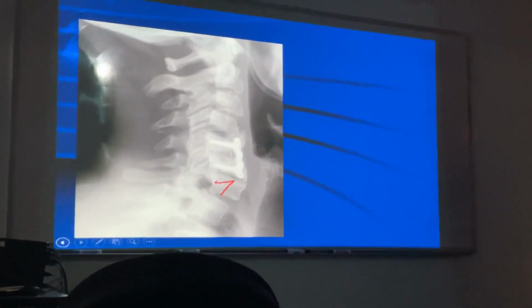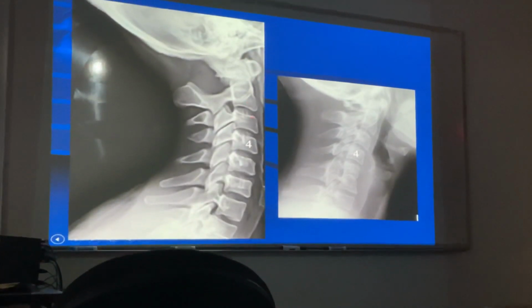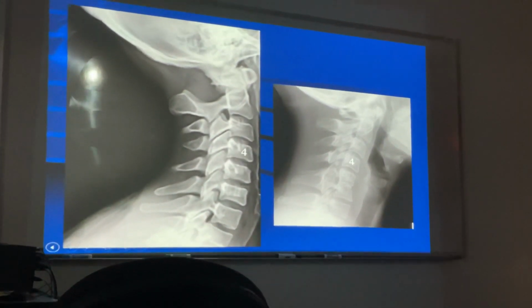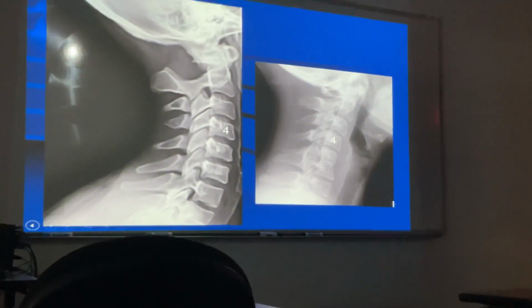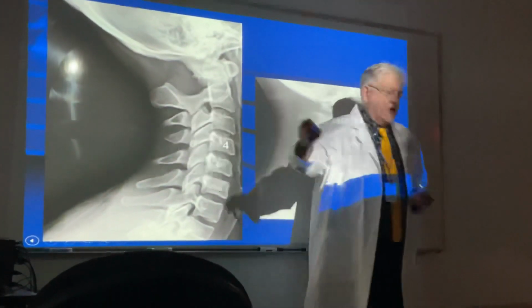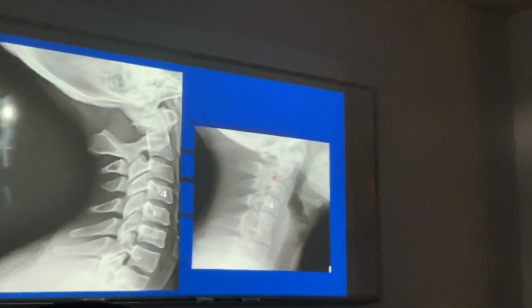We showed you this before. I think this is where we're sort of where we left off. Okay, so what was the abnormality here? No posterior arch. Good. No posterior arch is the clinical finding. What's the clinical significance? No protection. No protection. At risk. Okay. Their canal in this area is at risk. Okay, and then we said there were certain things we needed to consider. What was going on here?